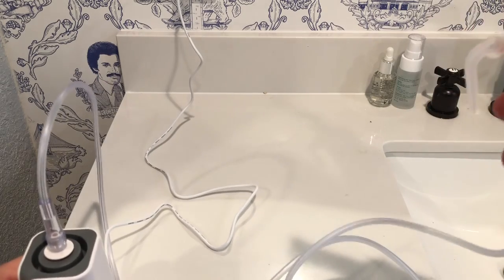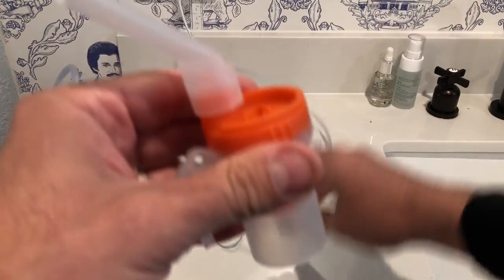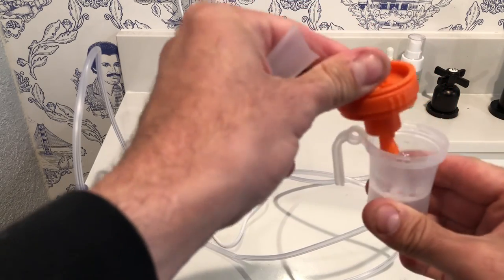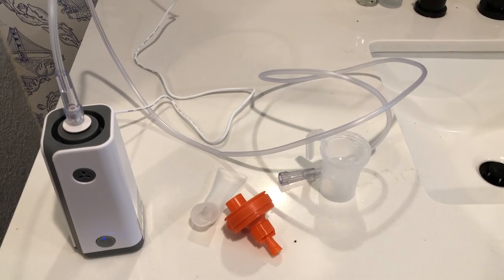Now you'd be ready to go ahead and remove the hose piece, and then remove all of the attachments and make sure you're sterilizing and keeping everything clean. I'm really glad we have it — and like I said, it fits adults or kids.